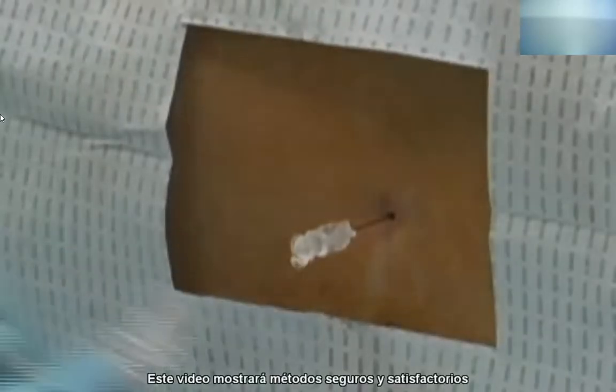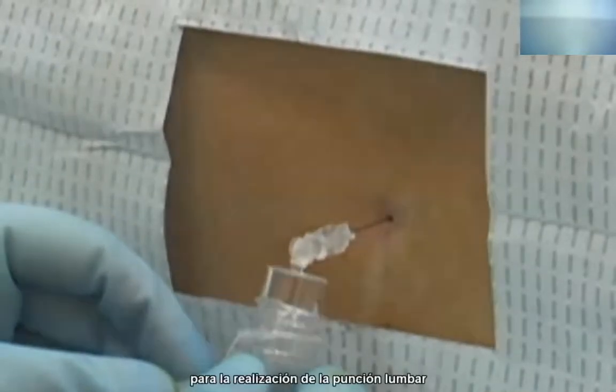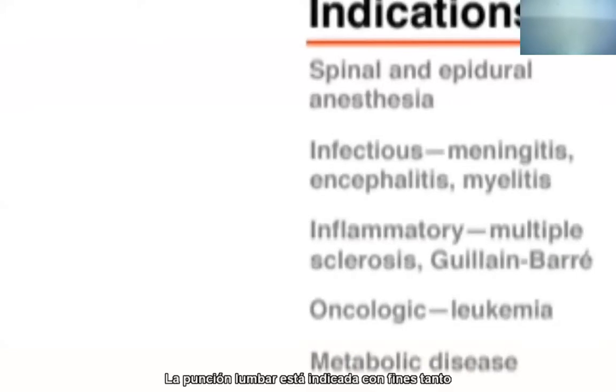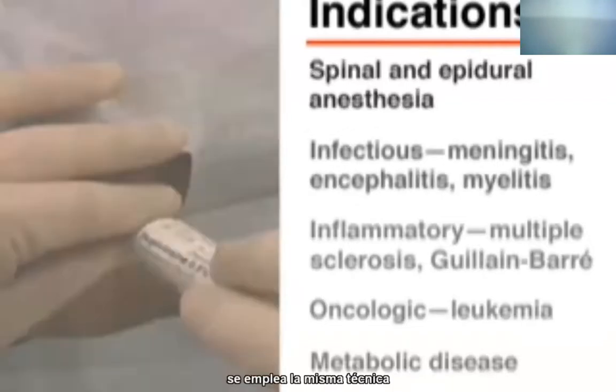This video will demonstrate safe and successful methods of performing lumbar puncture. Lumbar puncture is indicated for both diagnostic and therapeutic purposes. Also, the administration of spinal and epidural anesthesia involves the use, essentially, of the same technique.